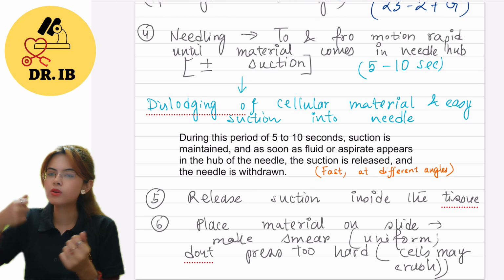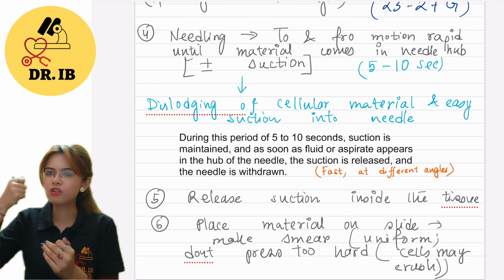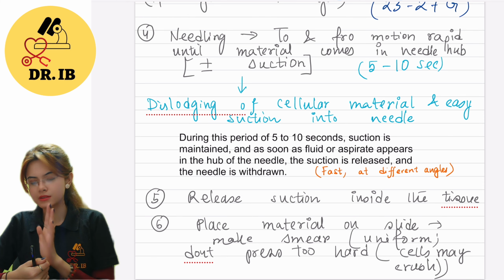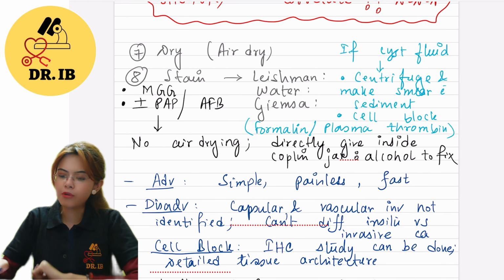Don't push it, don't pressurize it, don't force it. Just lightly make the smear, because if you're giving a lot of pressure, the cells will break. So after you are done, you have to dry the smear and do a proper staining.